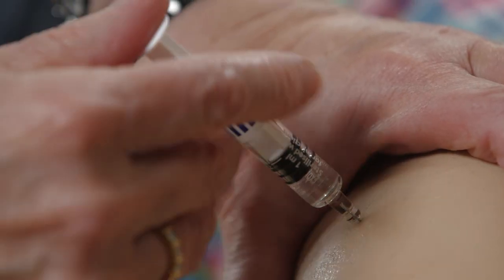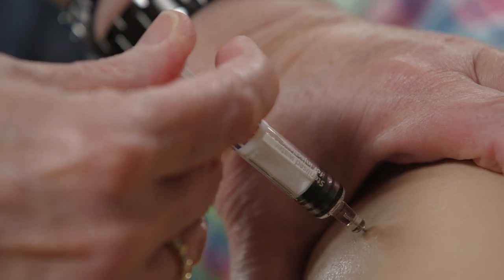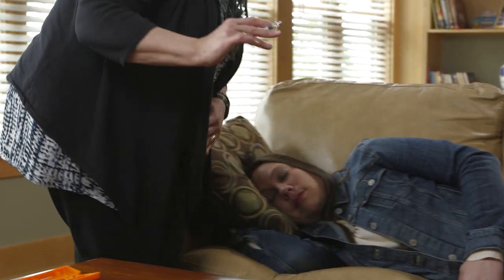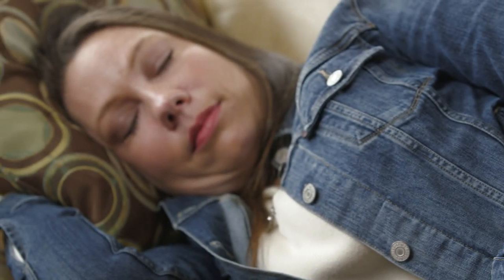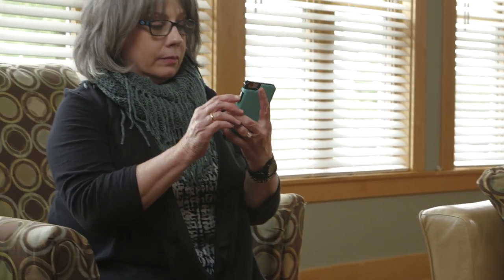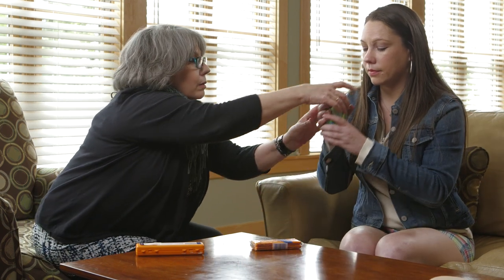Insert the needle into your child's thigh and inject the entire contents of the syringe. Withdraw the needle from the skin and set aside. Turn your child onto their side in case of nausea or vomiting. At this point, call 911.